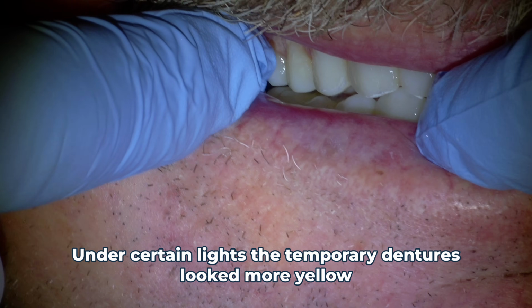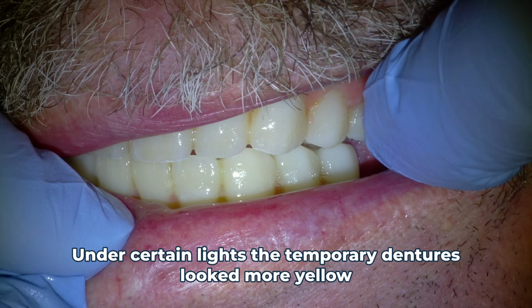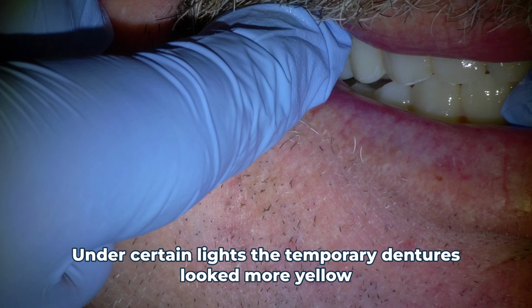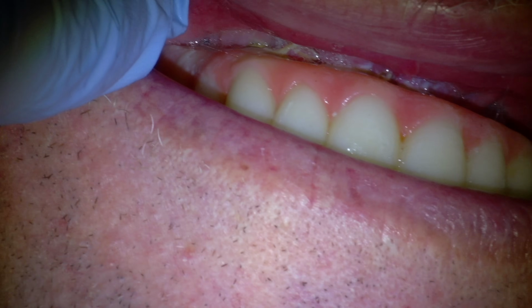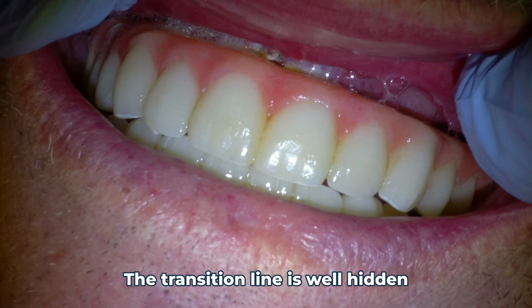Now, those were his concerns. I, on the other hand, think we need a few other changes cosmetically. For example, he's showing a little too much of the lower teeth when he smiles and not enough upper teeth. But that being said, that is what I love about this process that I'm using here. All of that is so easy to adjust.